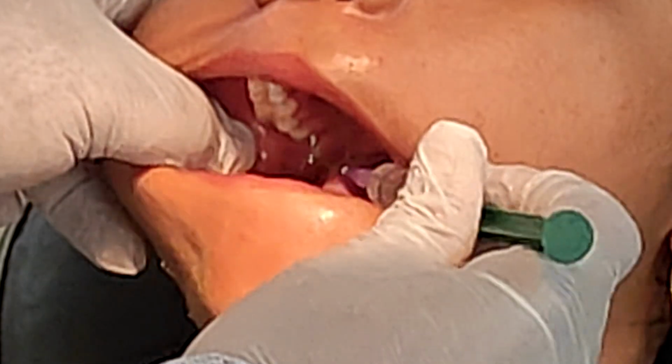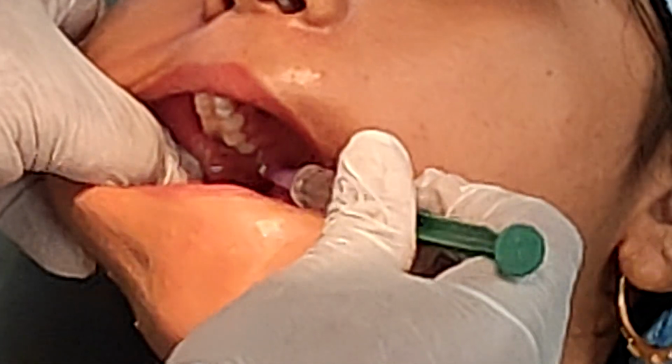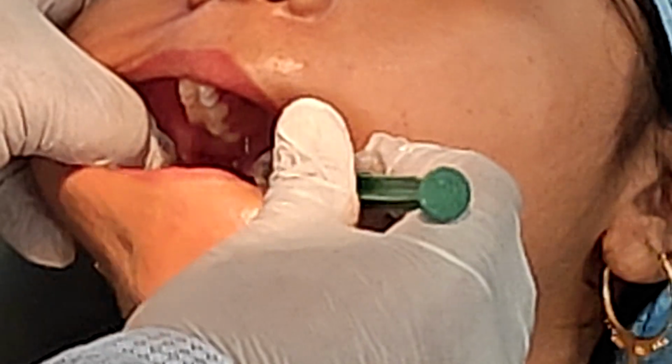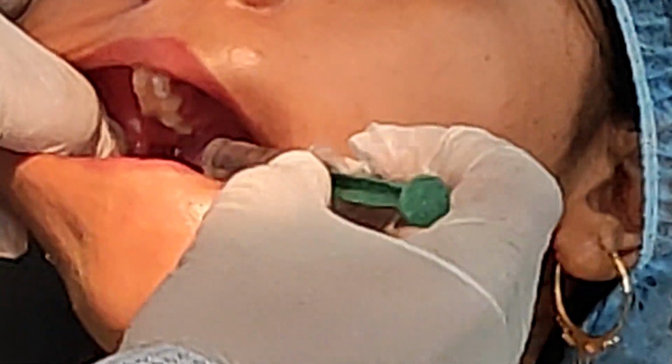So once I enter from the opposite side of the premolar, at the height of my thumb, which is approximately 6 to 8 mm, insert the needle. Approximately half of the length should be inside the mucosa.